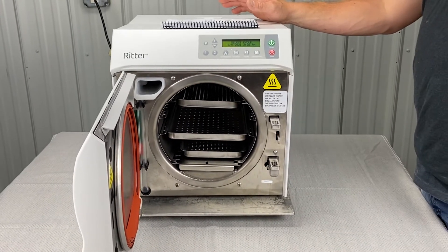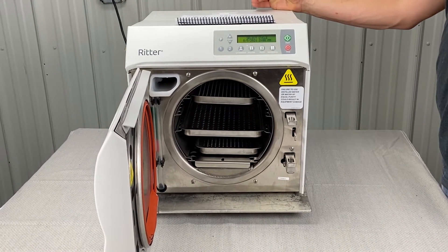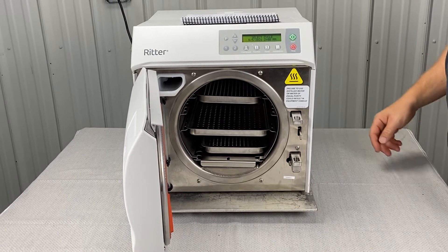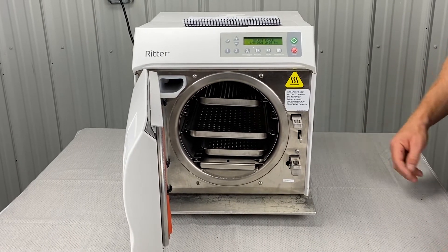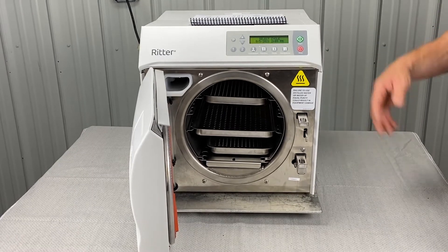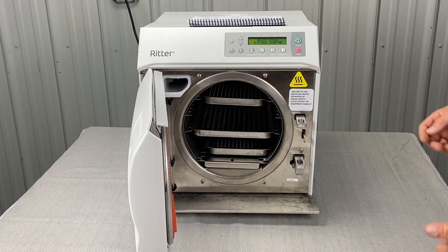Just a note: every seven days, as long as the unit is plugged into a power source, the autoclave will automatically display a 'perform weekly maintenance' message. If the power is disconnected, the cycle of weekly messages will be reset. So as long as you plug this in every seven days, it'll tell you to do your weekly maintenance and drain the water out.